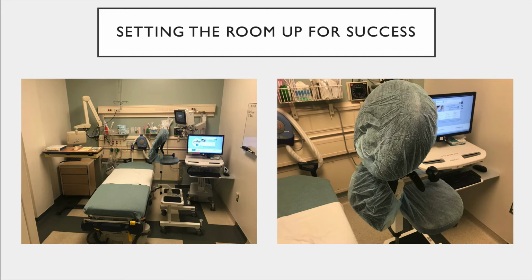The patient and the computer will be on the same side. And the reason for this is Sione or somebody else will help start the chart for the patient so it can capture all the vital signs during the epidural placement. Of course, the patient's going to be sitting on the bed, and the massage chair will be here. He will be on the other side with the bedside table as well as the kit. And we'll get a close-up of what's on this table in just a moment.